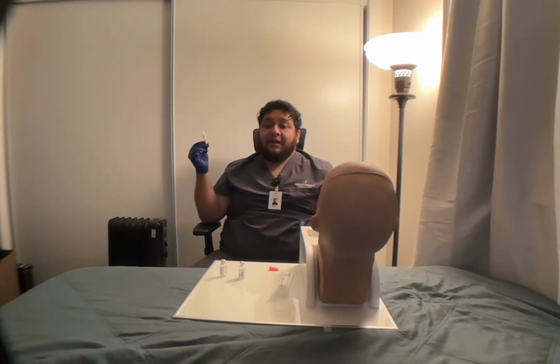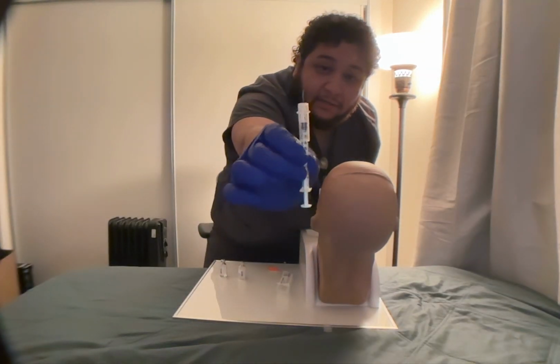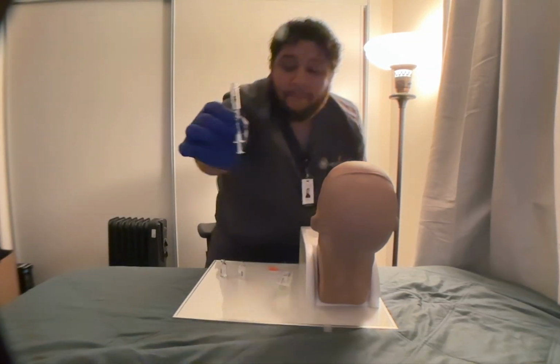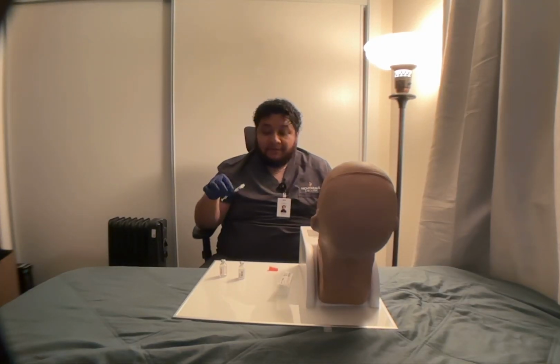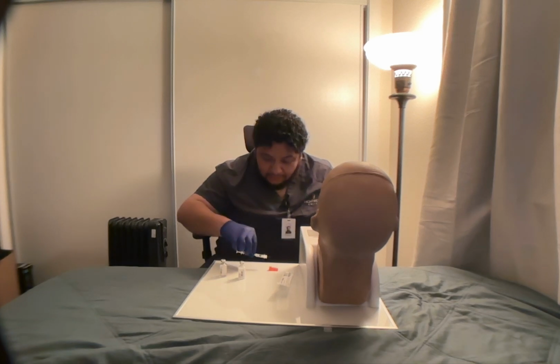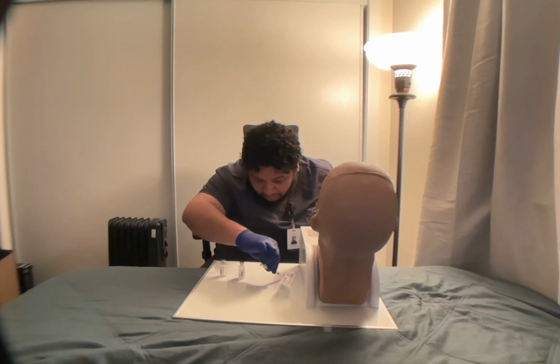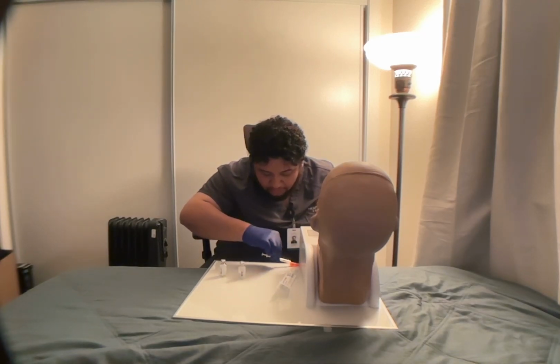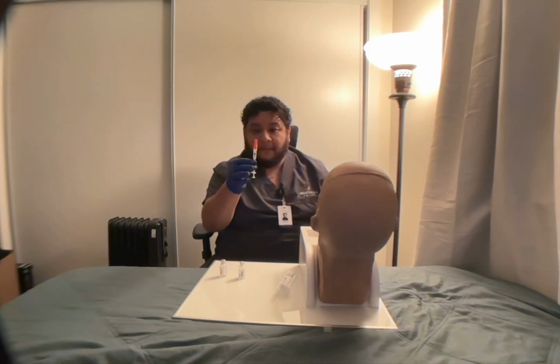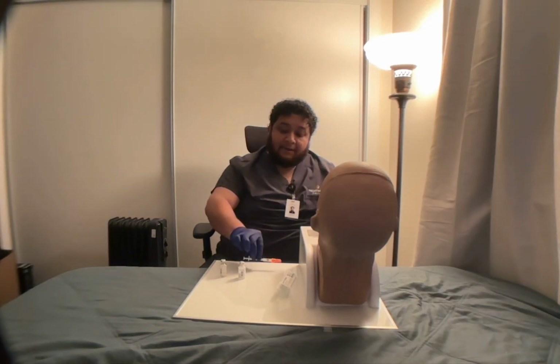Verify with the nurse and verify against the MAR. I'm going to show the camera 12 units. You can see that. Okay, 12 units. Now I'm going to cap the syringe using a scoop method, like so. I'm going to cap, and now I'm going to place it down.